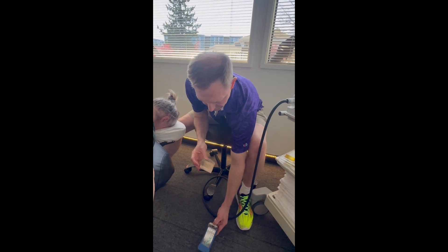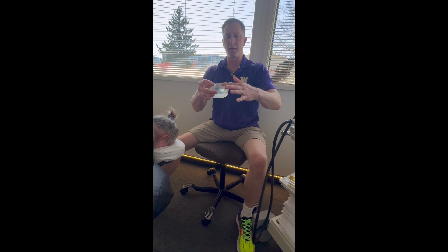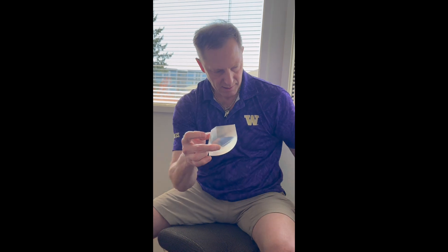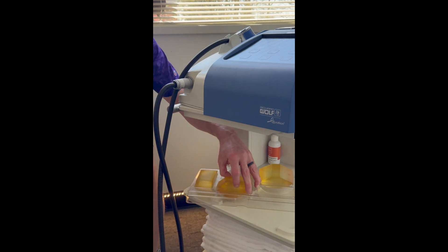Now here's the other thing about choosing the applicator. I choose based on what depth I want to reach. I don't want a shallow depth — I want a flatter, deeper penetration. For this patient, I want to go deep, so I'm going to use a really flat one. I'll also alter the frequency — the number of times it hits per second — and the intensity, to make sure I don't cause too much pain.